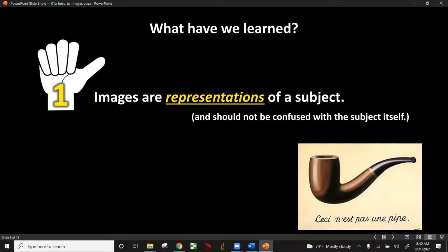They wouldn't say, here's a brain, right? They would start a little bit more systematically, like you were doing: a T1 weighted image, axial slice of the brain, right? And you might say a few more things. There might be an abnormally enhanced signal in a particular region that may be consistent with a hemorrhage, right? That's the kind of language which is an interpretation of a representation of the subject.